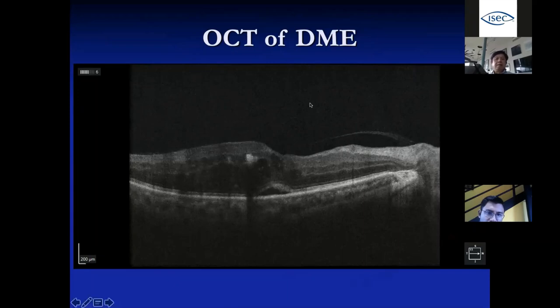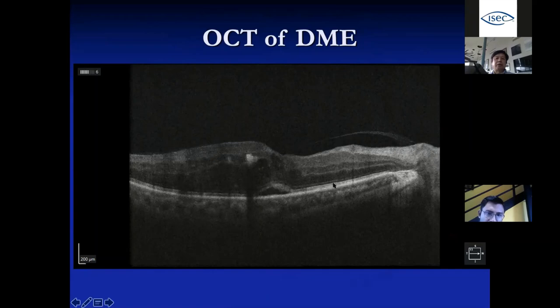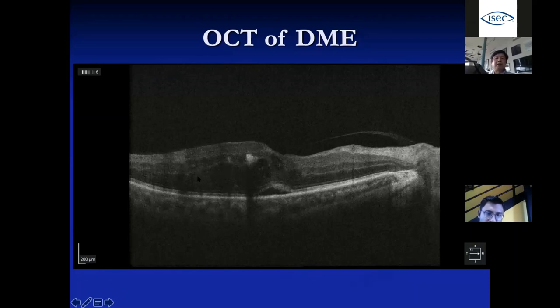OCT is very important when evaluating non-proliferative or proliferative DR, especially when there is no vitreous hemorrhage. You can see the retina here is swollen — normally we can see distinct layers, but here there is fluid collecting underneath the retinal layer (sub-retinal fluid) and fluid within the retina itself, seen as black cysts. This is called diabetic macular edema. If the fovea is affected, the patient may have vision of 6/12, 6/24, or 6/48.